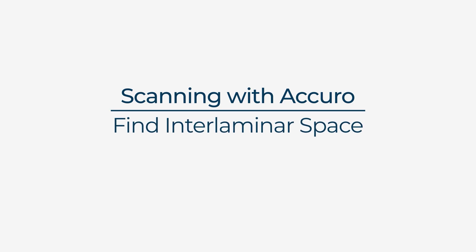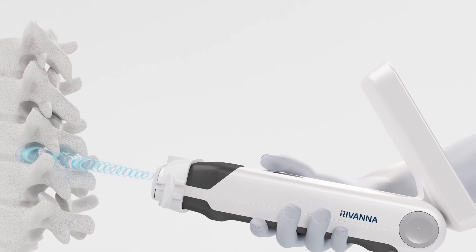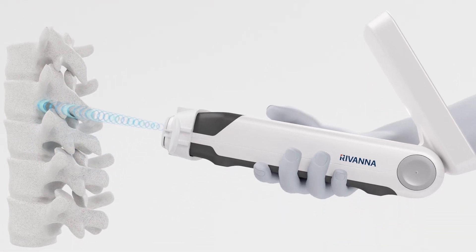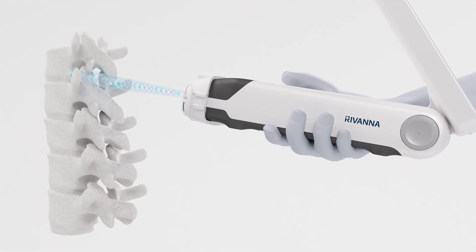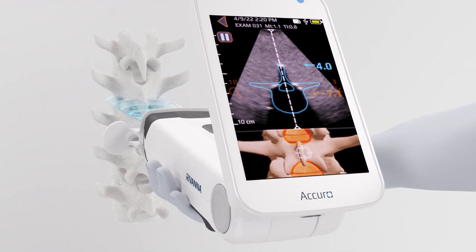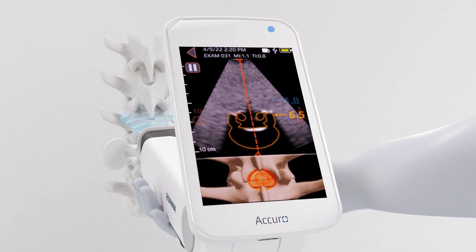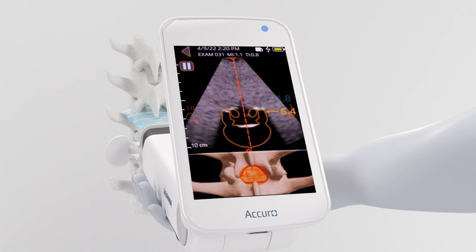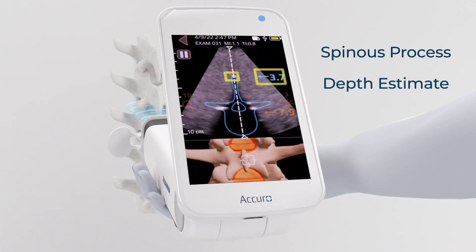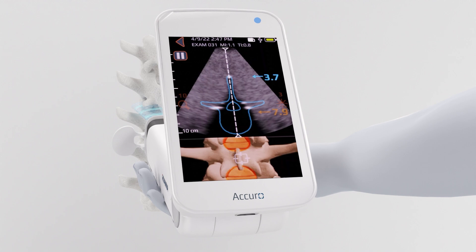Find the interlaminar space. Holding Acuro firmly, scan slowly, vertically along the spine, using the same trajectory angle you typically use for injections. The scan plane will intersect spinous processes and interlaminar spaces. When the scan plane intersects the spinous process, the ultrasound image displays a blue overlay and the depth estimate to the spinous process.